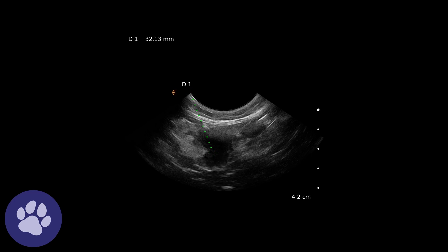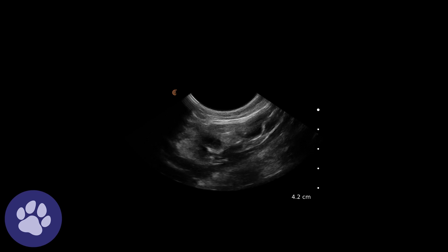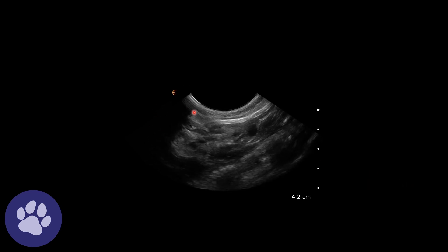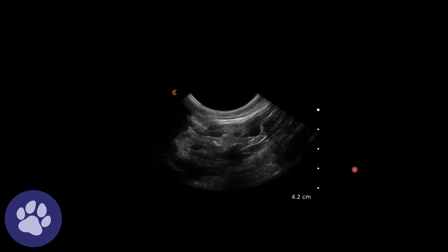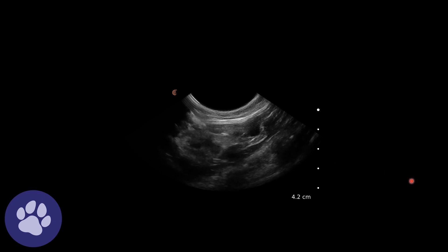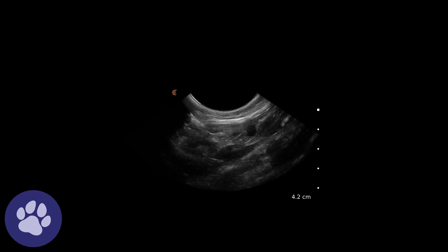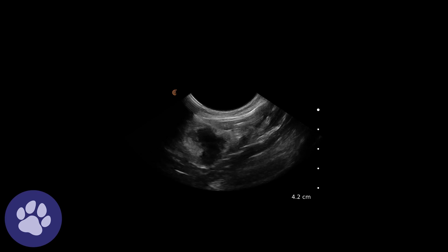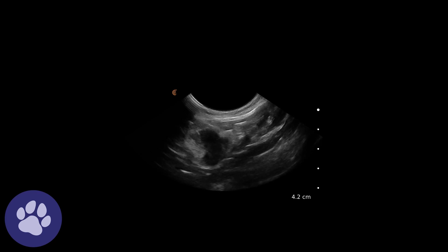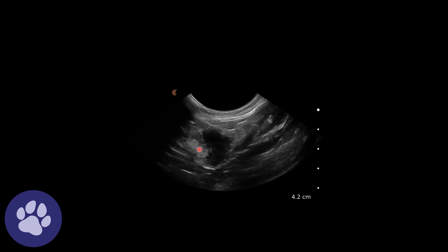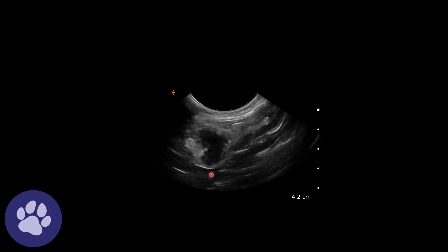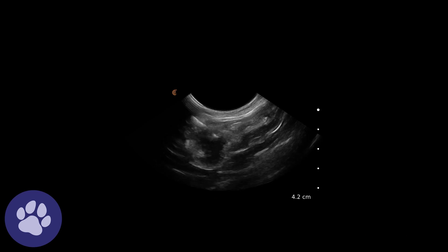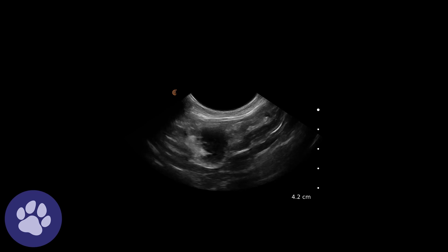Now assessing the mass for a fine needle aspirate. I like to measure from this point down to the lesion so I know what needle length I need. Here we're taking a fine needle aspirate — we can see the needle entering here, the mass here, and following that down, we can see the needle tip with just a little woodpecker movement to get some cells before withdrawing the needle. We repeat this. Here we can really see that mass moving all by itself, so we can see that this hyperechoic area is actually part of the mass — that's really useful. Sticking the needle into the mass, then woodpecker movement, and withdrawing the needle.